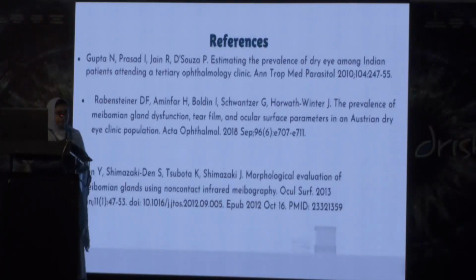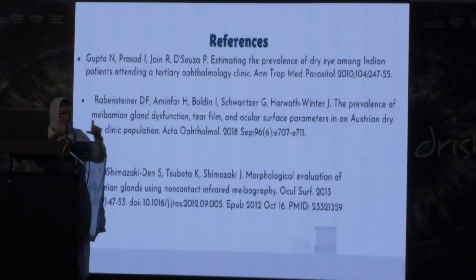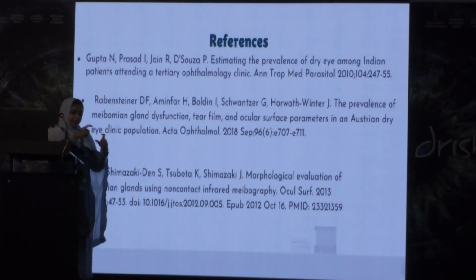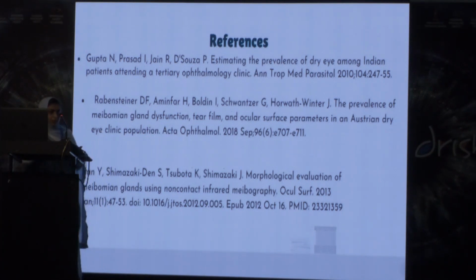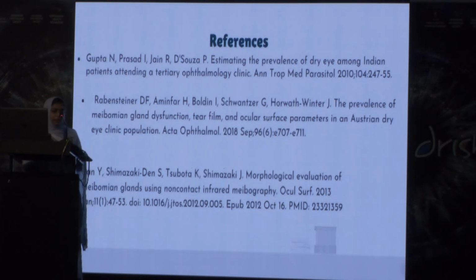Was there any difficulty in finding this dropout of the meibomian glands? Initially, it was actually only observer based. That is, the machine shows a specific area. So if we delete some area of selection, it will give us an error value. So after the pilot study with 20 patients, we found that we need to actually take the exact overlid or specify an area, which the machine normally showed. This was the only difficulty.